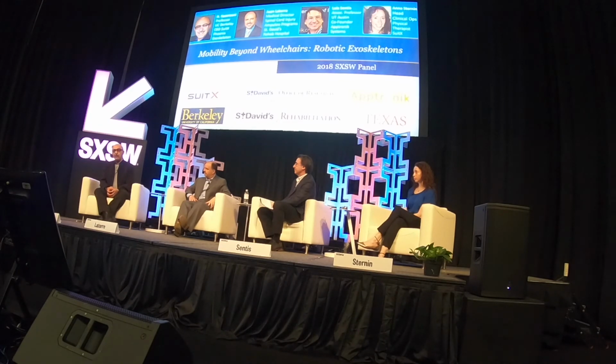There is also research going on on how to use brain-machine interface to generate the steps. And of course, as you mentioned, there are also possibilities that you use EMG signals. A good friend of mine in Japan, Dr. Sankai, is actually doing it. He's measuring EMG signals to generate steps. Another one that I like is voice activated, like go, no go, stop. All of these are categorized under human-machine interface. How do you tell the machine to do what you want it to do?